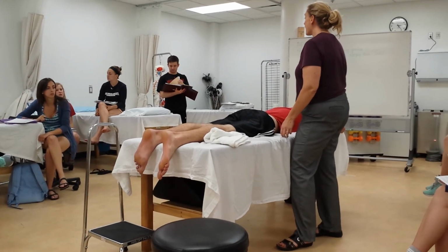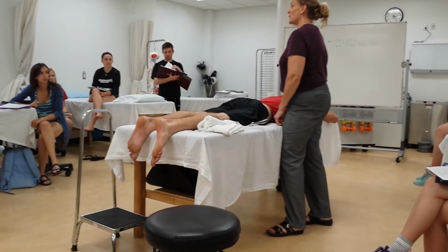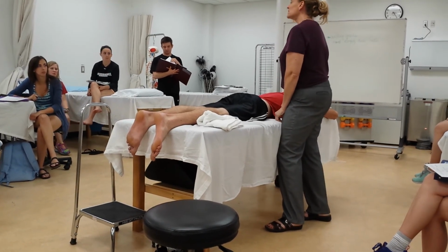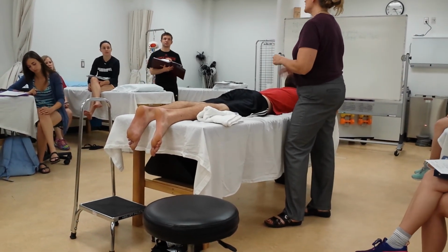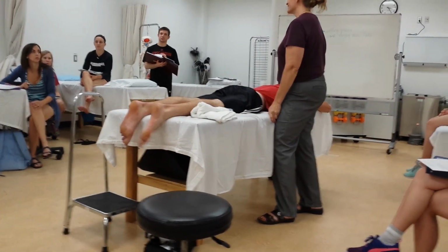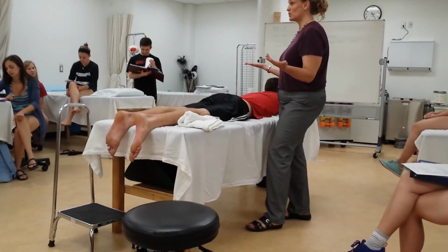But that's essentially what you want to do, is make sure that their pelvis isn't moving. I have a question for the medial and lateral. Mm-hmm. What's the normal end feel for that? So we're not talking about what is normal this semester. I would expect that you're going to feel capsular, although for some of your people, your piriformis is going to be tight, so when you go into internal rotation, you might have a muscular end feel. Okay? All right, so that's actually all 6 of your motions that you have to measure goniometrically.